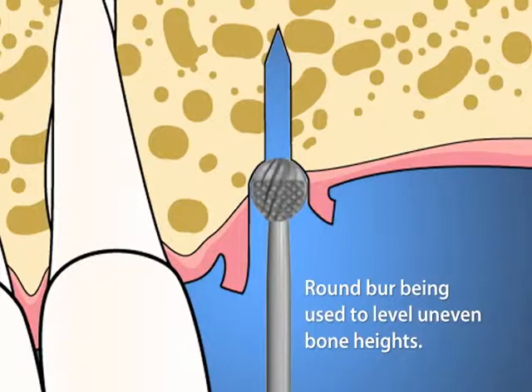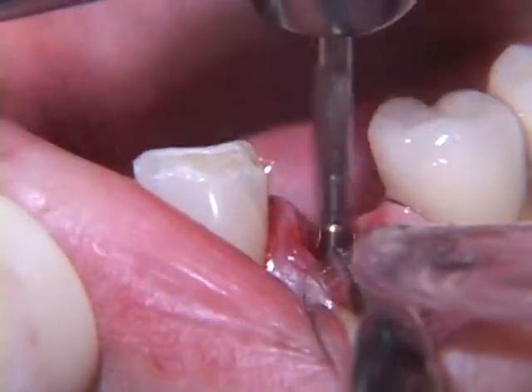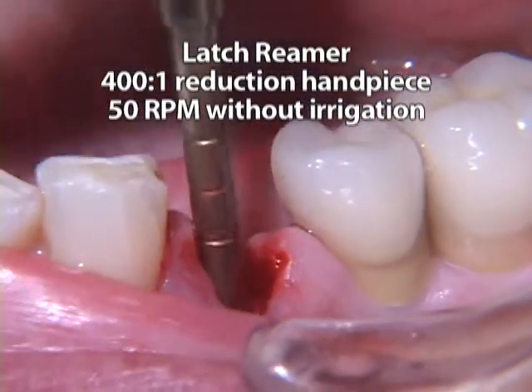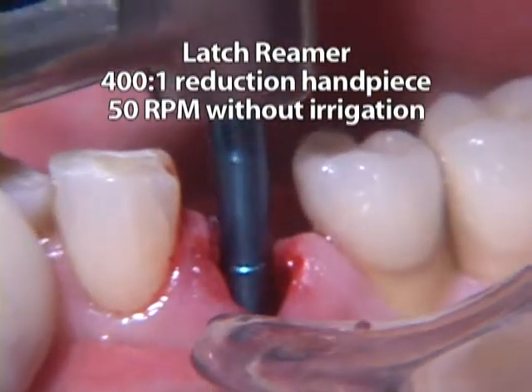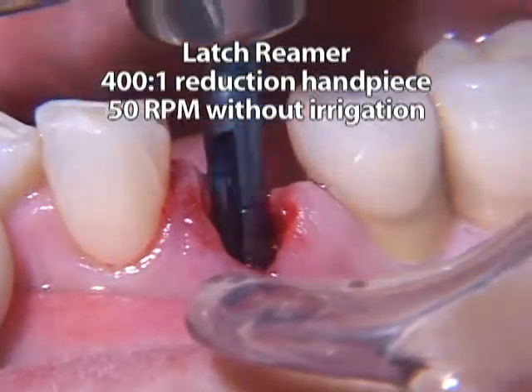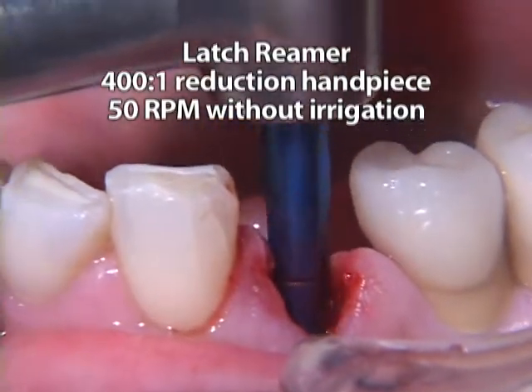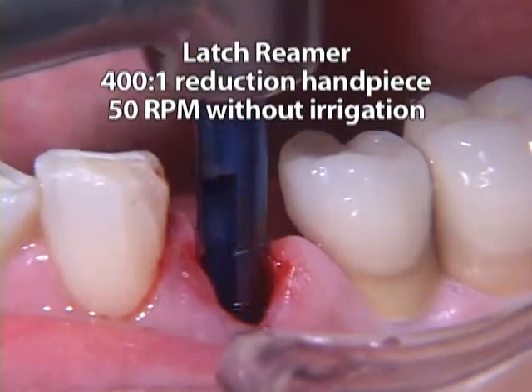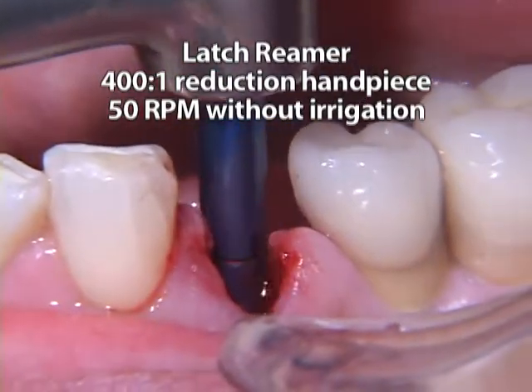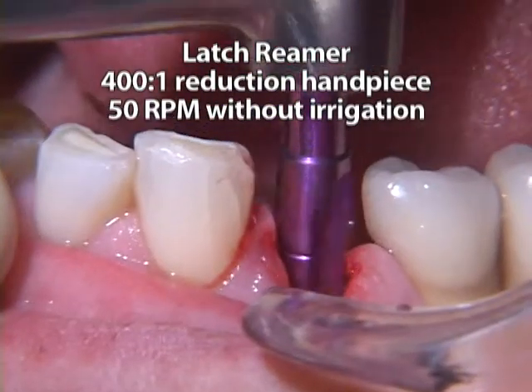The pilot osteotomy is initially widened with a 2.5 mm latch reamer and then with successively wider latch reamers in a 400:1 reduction handpiece without any irrigation until the diameter of the intended implant is achieved. Reamer burrs rotating in excess of 50 RPM may frictionally overheat the bone, potentially causing the failure of an implant to integrate.